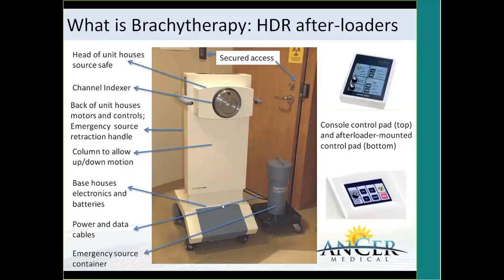The machine communicates with the control panel and a PC that stands next to it via a data cable that comes in the back of the machine. And usually the typical scenario where you're going to see those machines, they share a room with a LINAC. So you will see an enclosure, either closed or maybe a chain that locks the machine to the wall, and during treatment you open it or unlock it and get the machine outside. You will also always see an emergency container next to it.